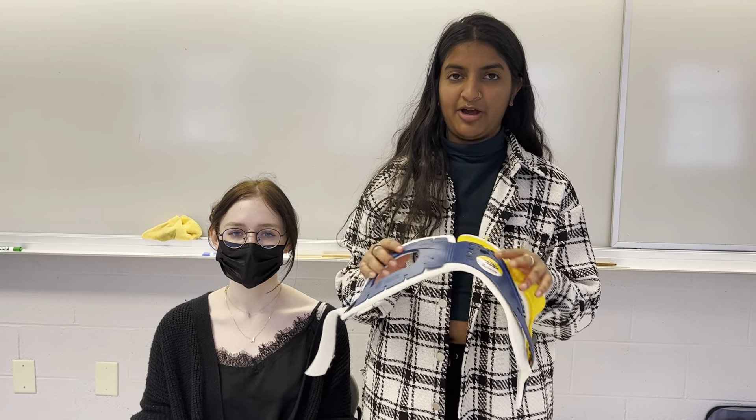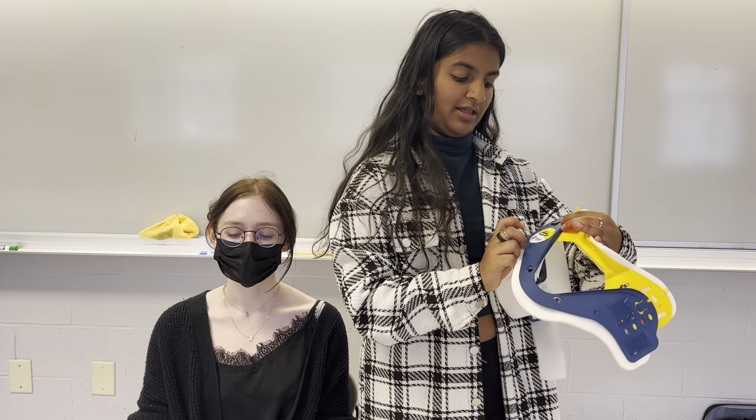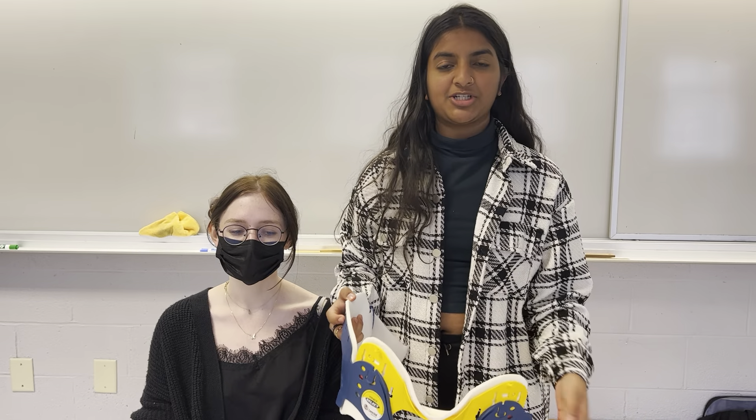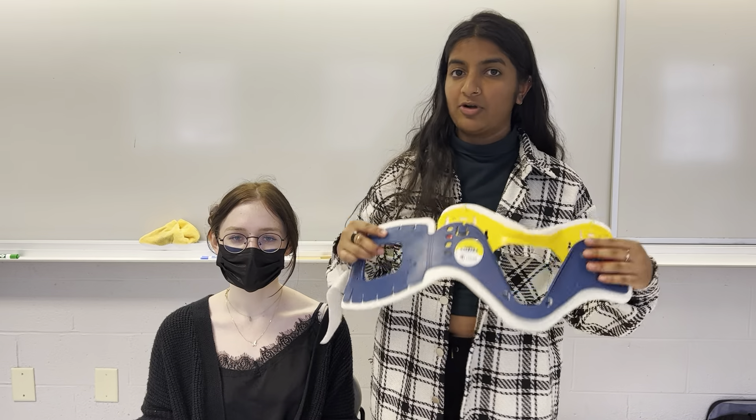Hey guys, today I'm going to show you how to properly measure the Laerdal Stiff-Neck Select Collar. This is specifically for this C-collar, but a lot of them work the same way. You just want to make sure you know how to do it for the equipment you have. All the ones at our site are this one specifically, so this is going to be useful for us.